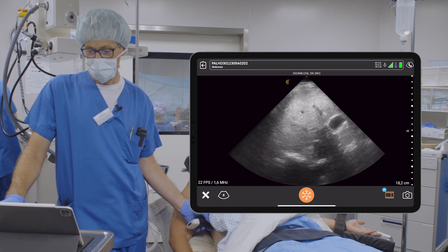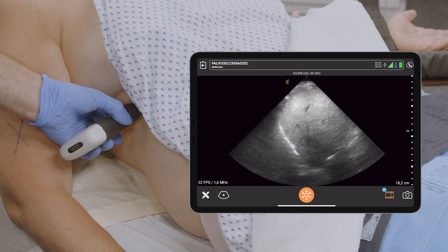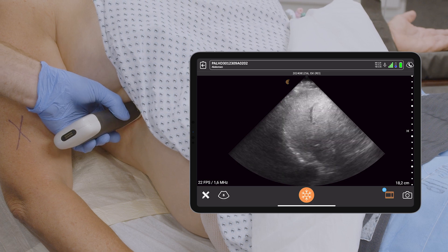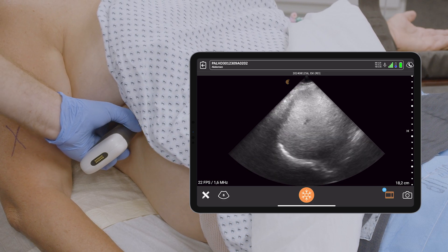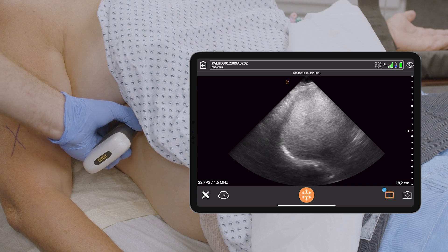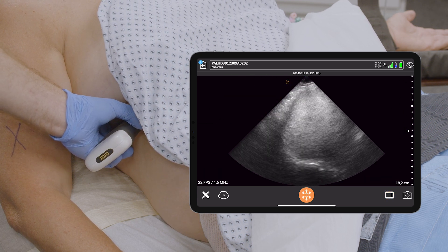And now the video is started. Können Sie tief ein- und ausatmen. Richtig tief atmen. We've got a dirty curtain coming in. Wieder ausatmen. Das sieht alles sehr gut aus. So this is a normal diaphragmatic function. Capture video — we'll stop the video.